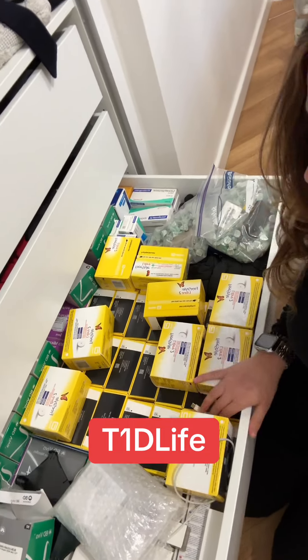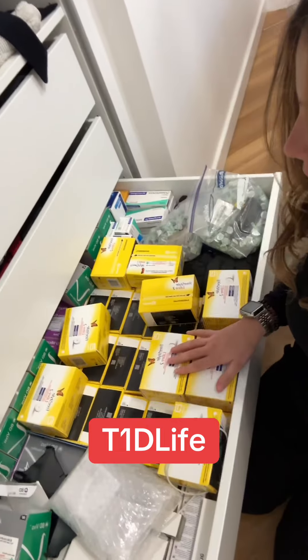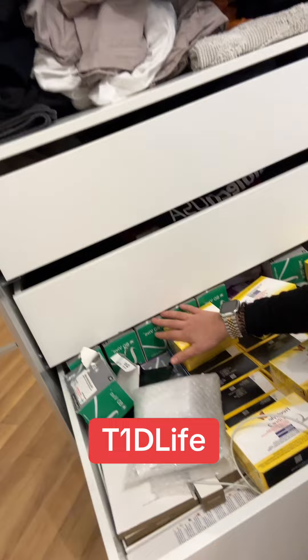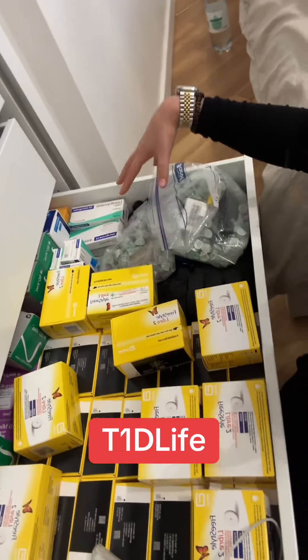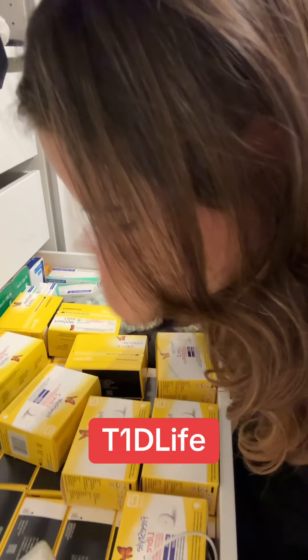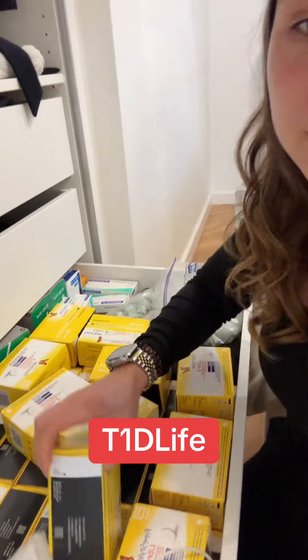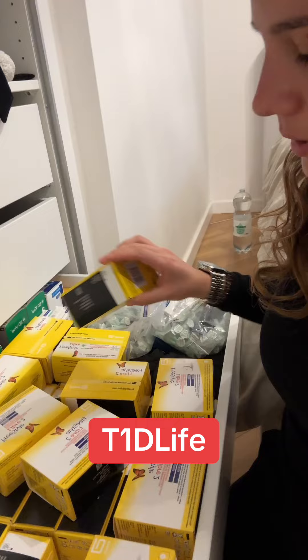This is my medicine drawer — I just got a notification that my sensor is up, so I need to go in. I've got my Libre, needles, levothyroxine, and a few other bits in here. The way I normally pick a sensor is I look at the date that runs out the soonest. There we go — 20 January 2025 — so I will choose this one.